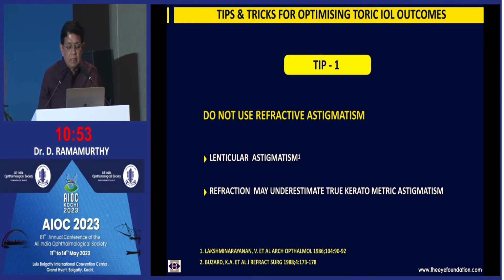These are just a few tips that I routinely follow in my practice. Do not use refractive astigmatism. All of us know that anterior corneal astigmatism is what is most important, and just using refractive astigmatism may mislead you.